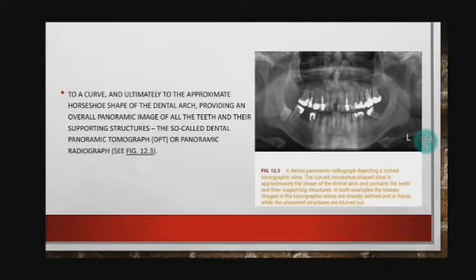In both examples, the tissues imaged in the tomographic slices are sharply defined and in focus, while the unwanted structures are blurred out. So first, the conventional tomography.